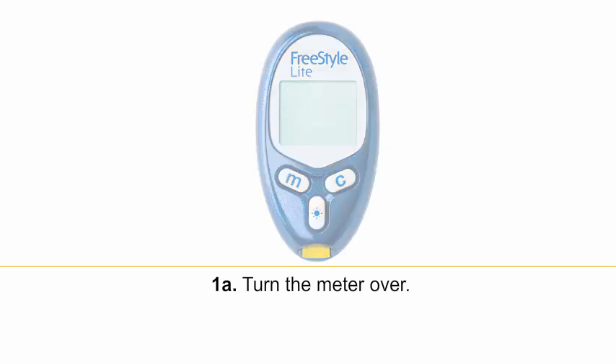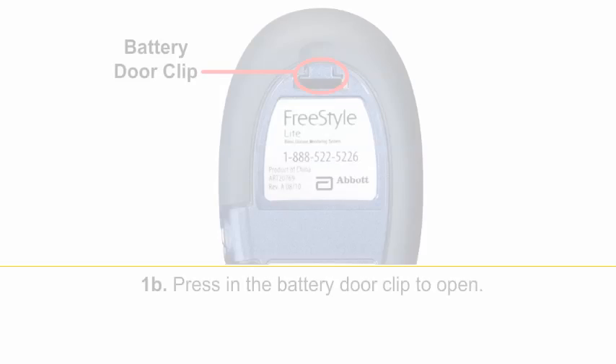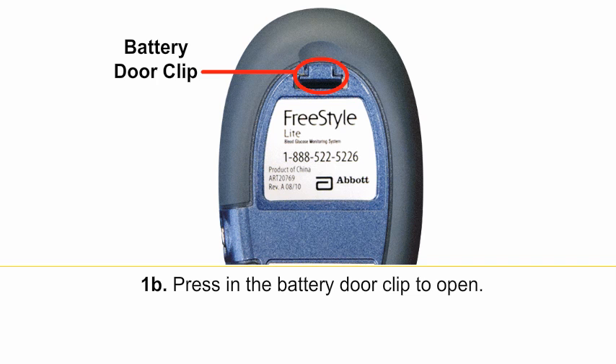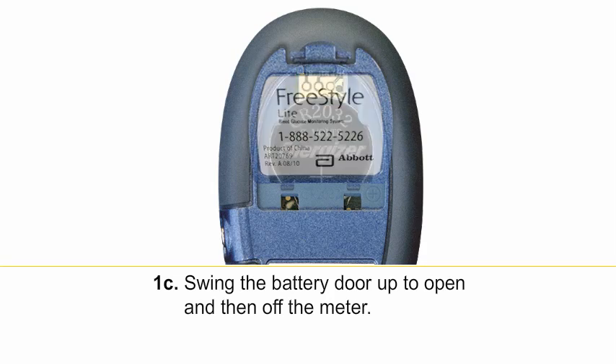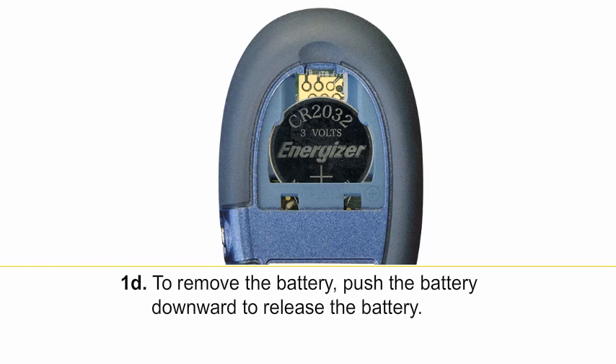Turn the meter over. Press in the battery door clip to open. Swing the battery door up to open and then off the meter. To remove the battery, push the battery downward to release it.